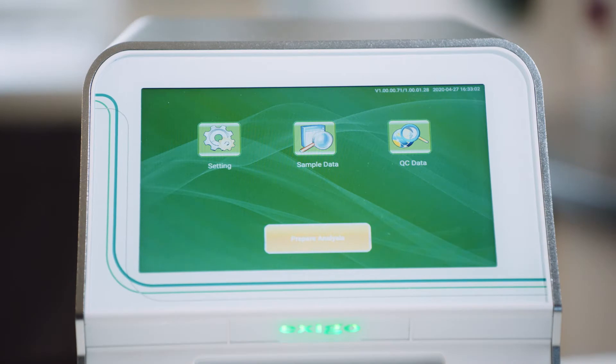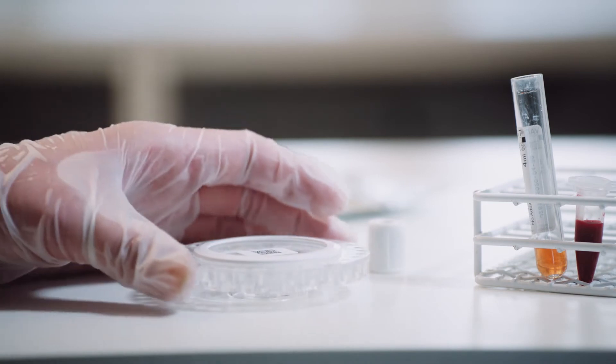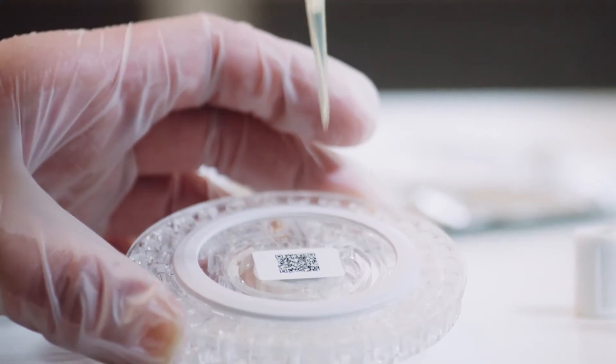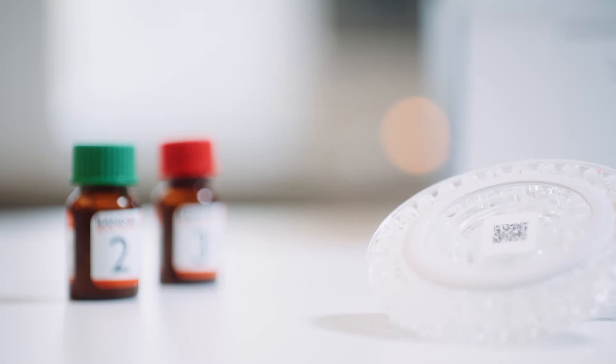The Exegos C200 has accuracy comparable to reference laboratories, as well as detection and flagging of hemolysis, icterus, and lipemic samples. This, along with each rotor's QR codes containing calibration, lot number, expiry date, and the built-in quality control run for each sample analysis, makes it easy to diagnose and safely treat patients.